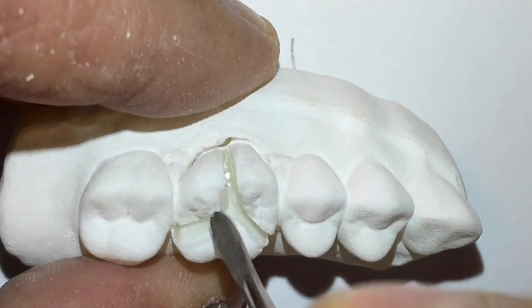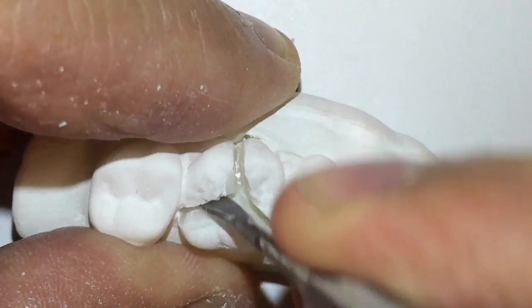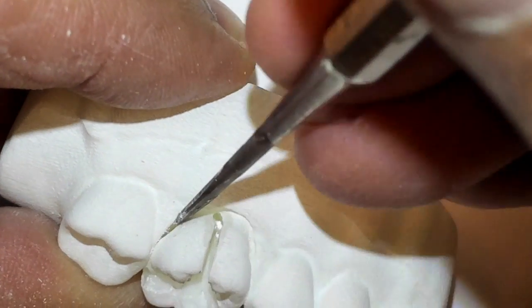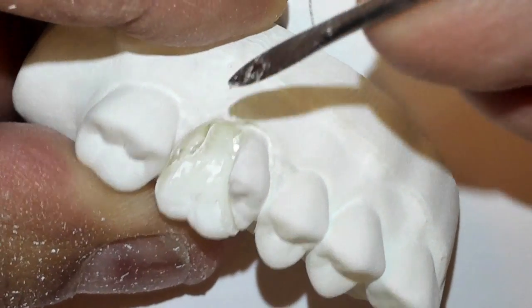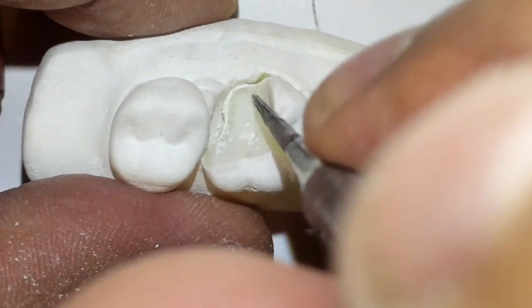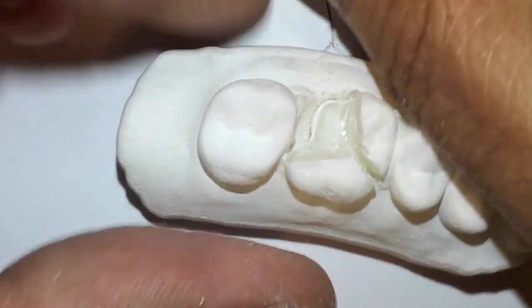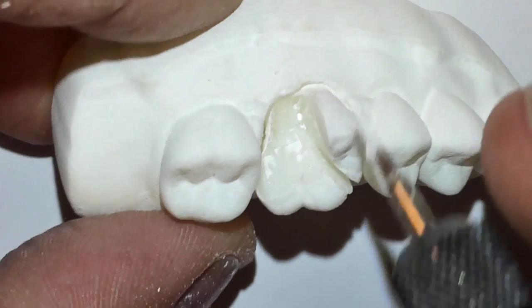You don't want to really break off the top — just kind of get the tooth a little loose, back and forth. Let's see if it actually is mobile. This piece looks somewhat mobile, but we're not quite there yet. Now there are purchase points that you can develop. This is the distal root — it's more conical. I just snapped off the top of the root and you can see now the furcation is wide open. So now we can go in and I'll store that piece next door. Now go right back in; you can deepen your cut and you've got much more room to see.